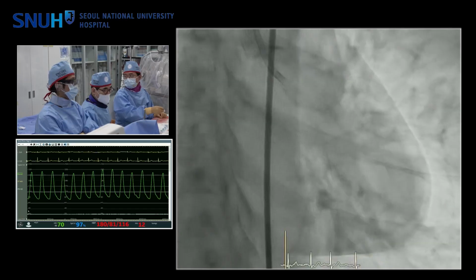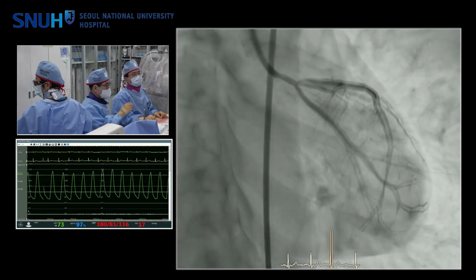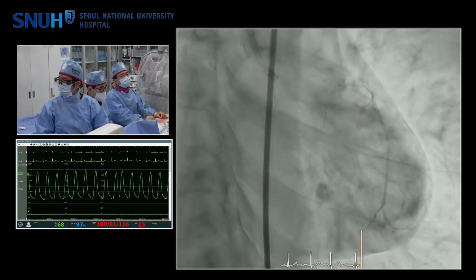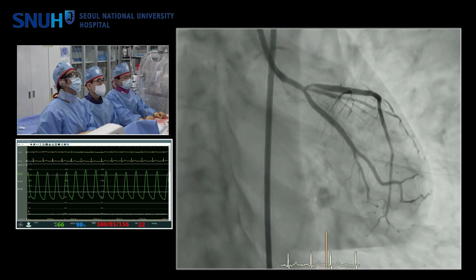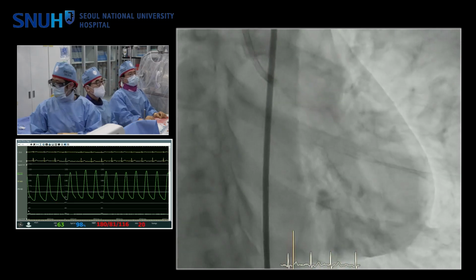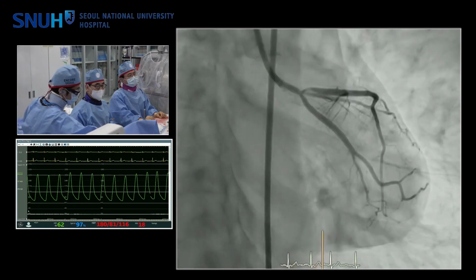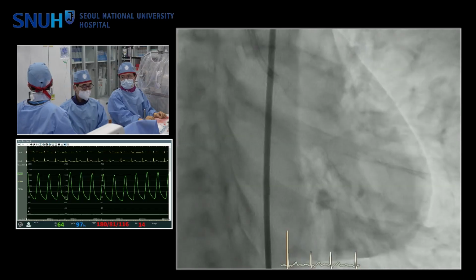Balloon. So he has already decided his plan to treat this case, but we can discuss, I think. For this negative remodeled left main and true lesion in the proximal area of the ostium and moderate stenosis in the LCX, any suggestion or comment from the panel?